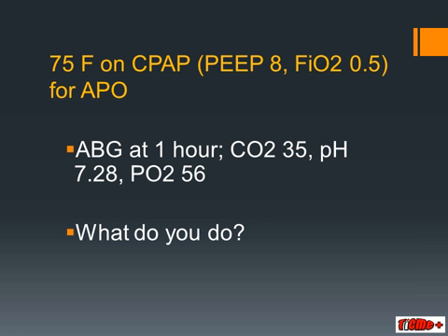Remember, if the patient isn't improving as you would expect, to look for complications. So at this stage, I would also repeat an ECG and can consider repeating the chest X-ray.